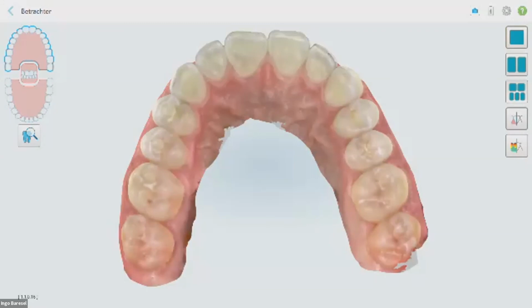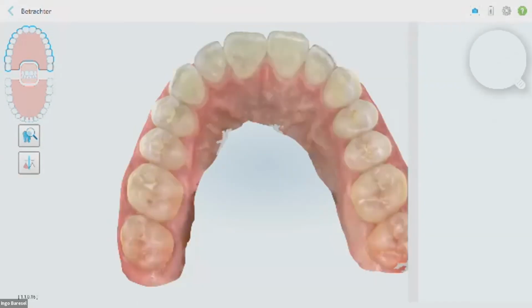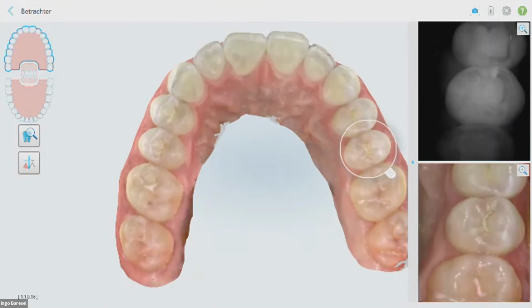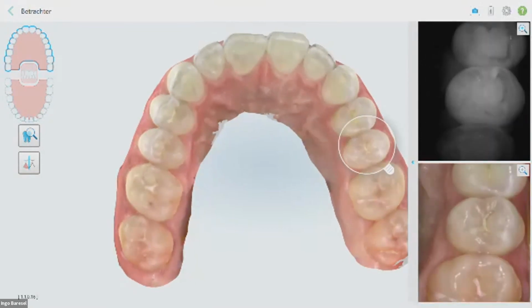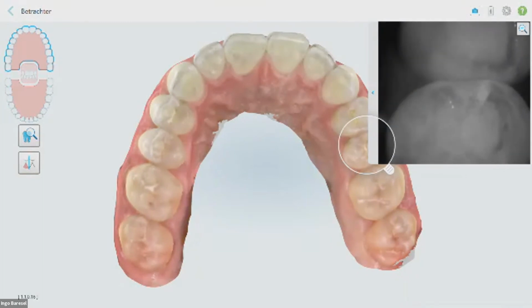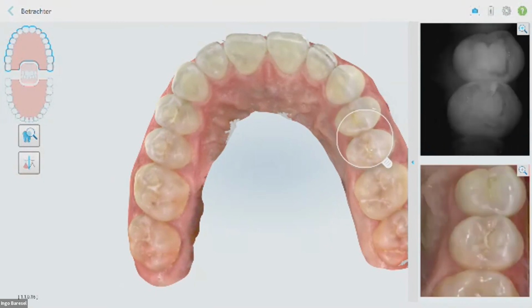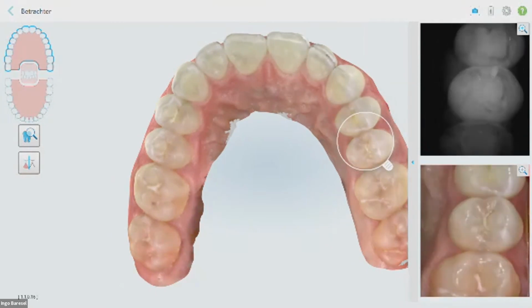Okay, back in my day, I want to show you a few things at the end. First of all, I'll show you again a little picture from the scanner, where by pressing just this one button we can go through the scan looking for some caries. You see on the lower side, you can enlarge it, the real picture. On the upper side, the NIRI, you can enlarge it. And you see in this case here some caries. So this I wanted to show you with the scanner.